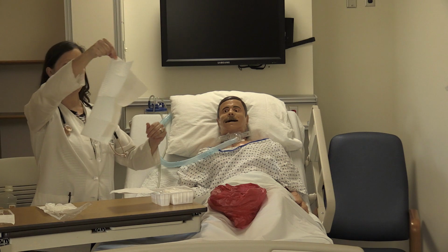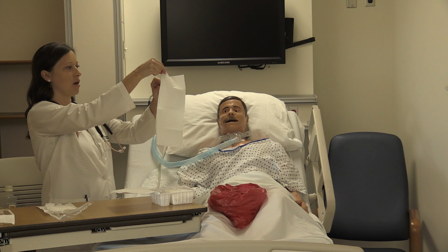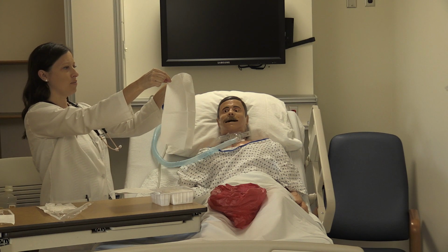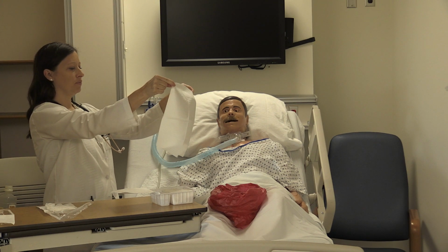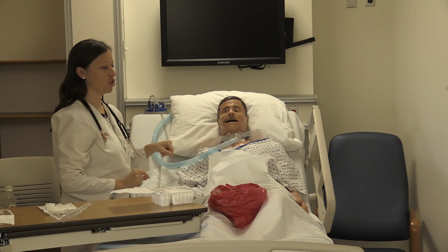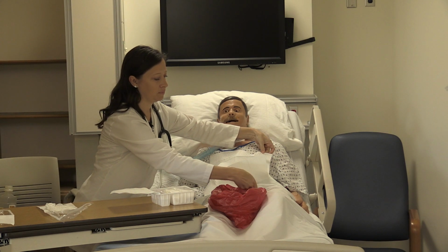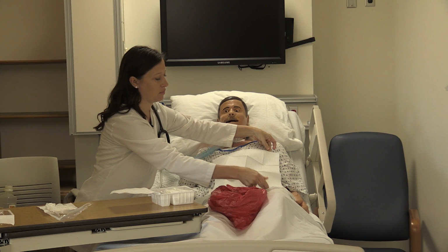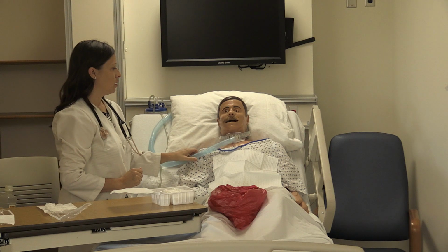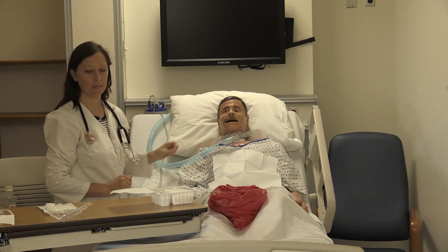You want to pick it right up off the table so it doesn't drag on anything, and you want to locate the other side of this. It's shiny side down. So you just kind of want to drape this just over their chest so you have it available. Okay. And you want to make sure that you can get this oxygen moved easily.